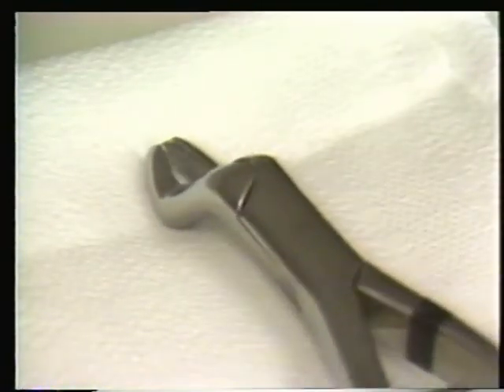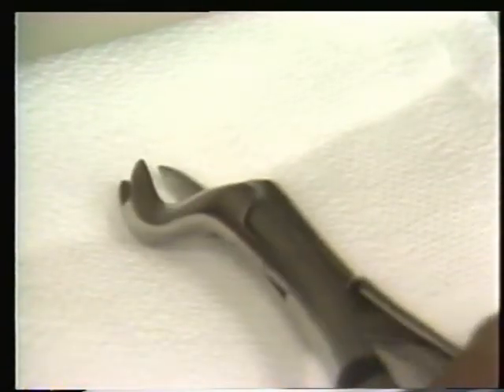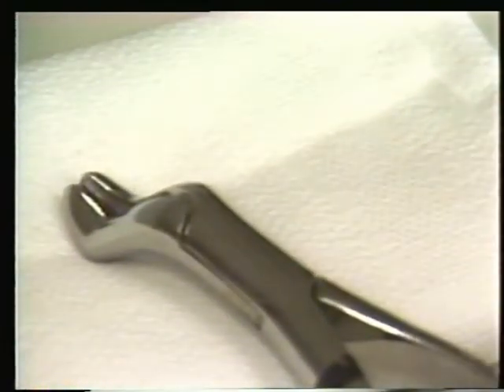forceps for right and left maxillary molars, number 88 maxillary anatomical forceps paired for right and left maxillary molars, and the number 210 for maxillary third molars. Then the mandibular forceps.